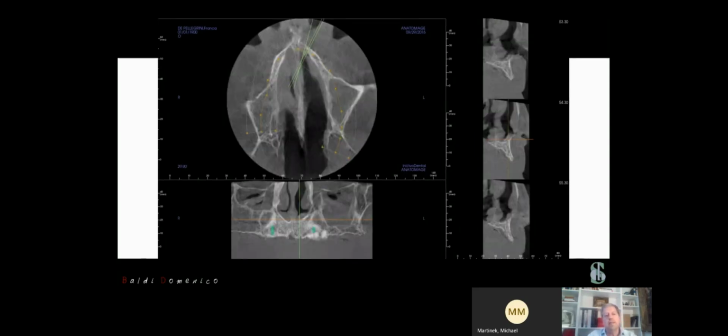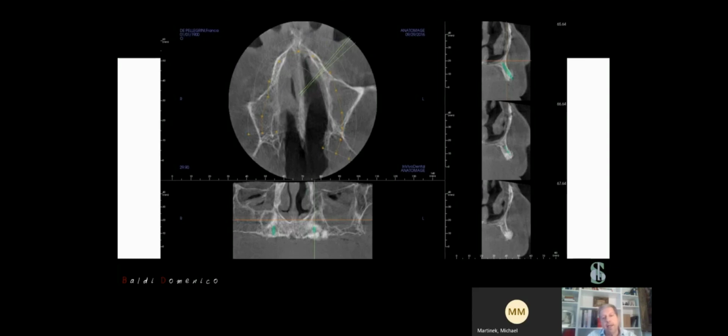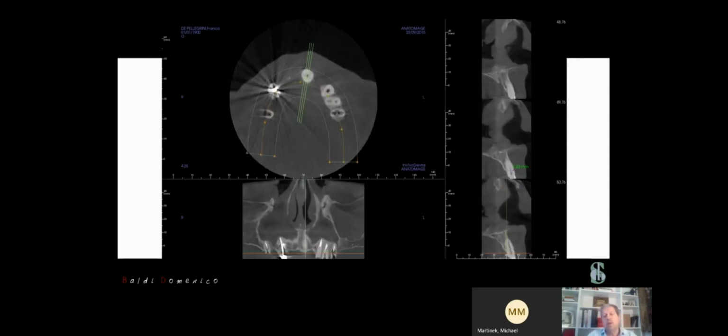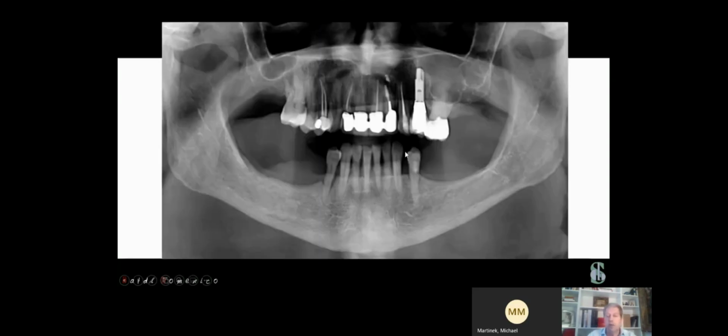And you can see in this CT how the situation changed completely after 6 months. So you can see how on the right side the bone was resorbed. Instead, on the left side, where we placed the filler, we maintained a good quantity of bone. And if we see the measure, where we had the root before the extraction, we had a size of 6.40 millimeters, and in the same place after 6 months, we had a size of 2 millimeters. It means that we had a very strong, very high resorption of our bone.